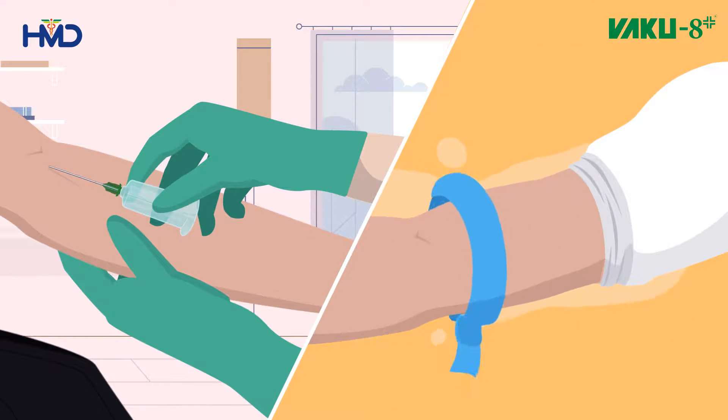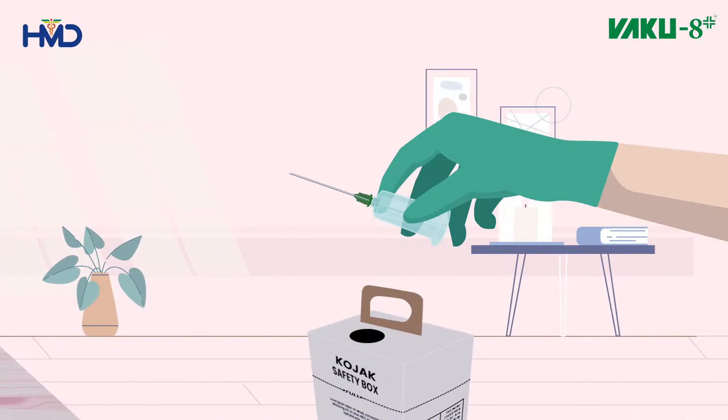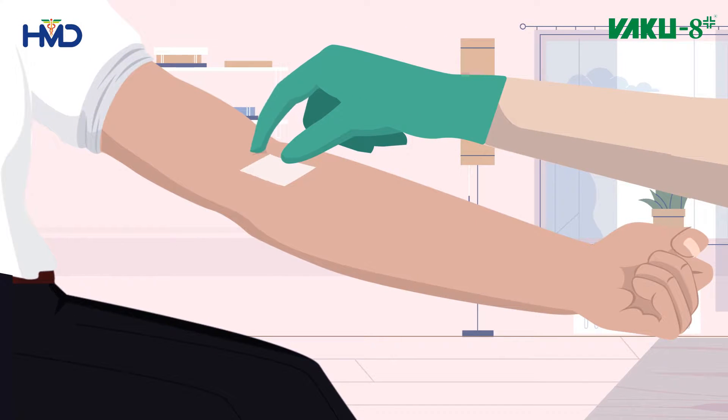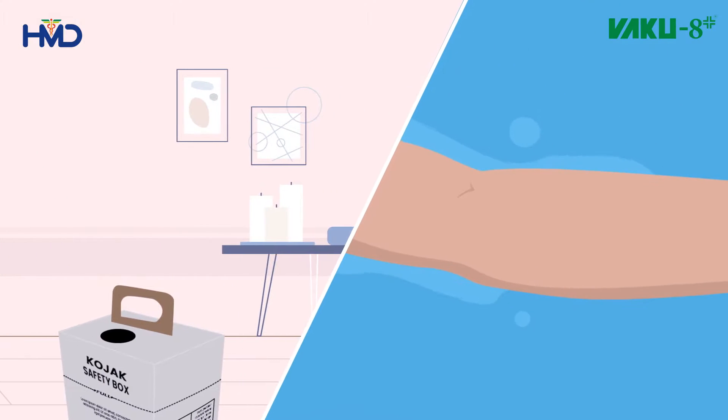Remove the tourniquet. After you are done, slowly pull out the needle, dispose of it in a sharp box, and press a piece of alcohol swab over the injection site for 30 to 60 seconds to stop the bleeding. Apply a pressure bandage at the site of venipuncture.